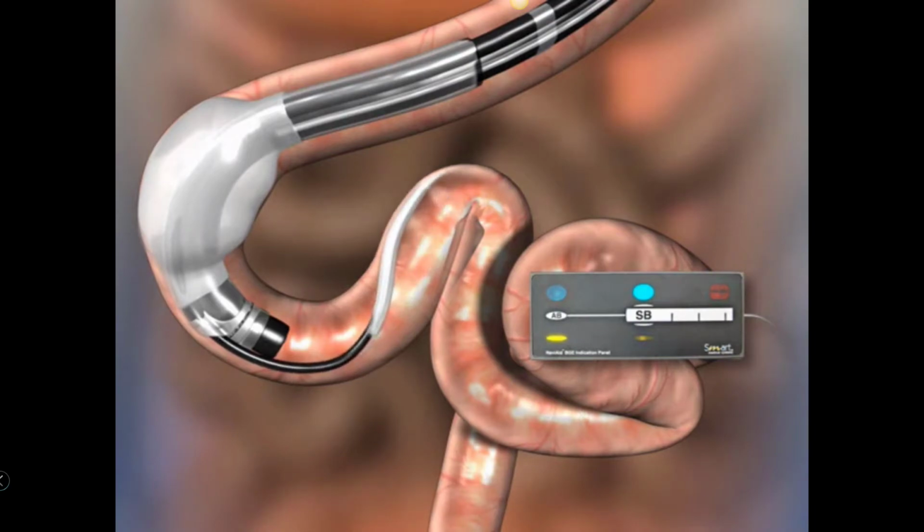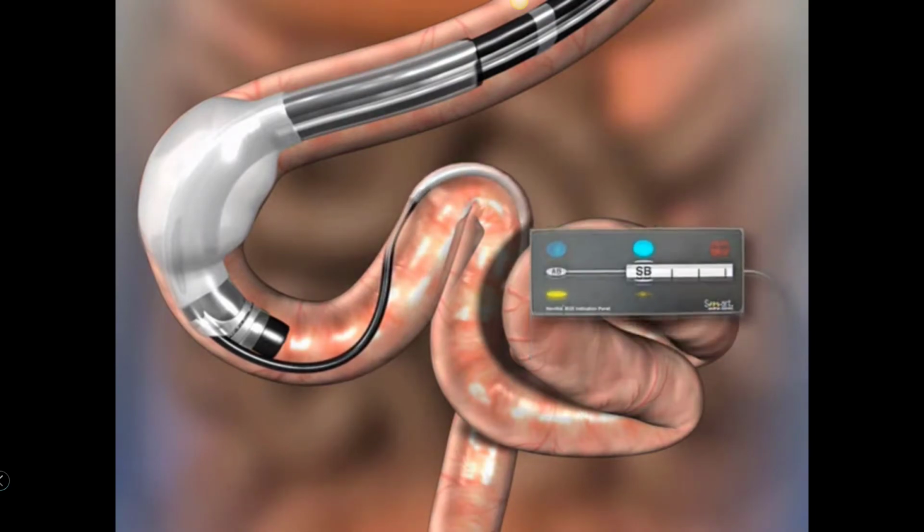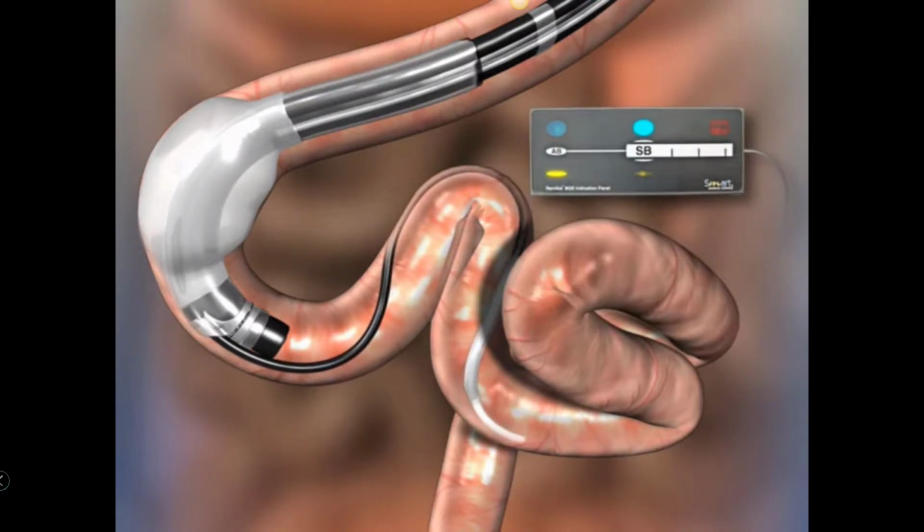Subsequent steps are performed as needed, advancing the standard endoscope deep into the small intestine.